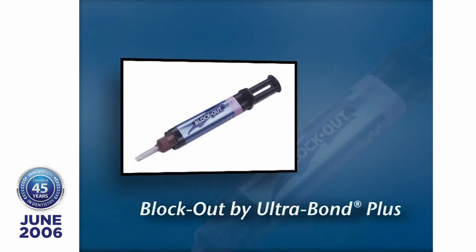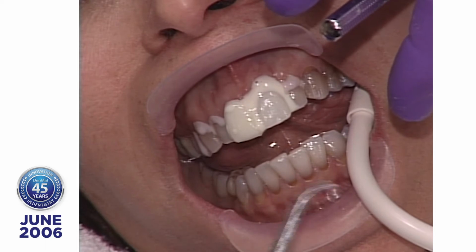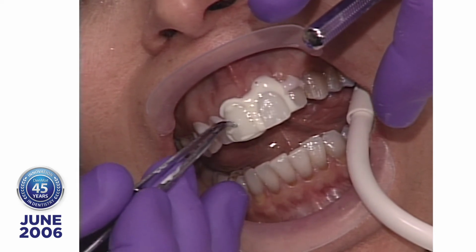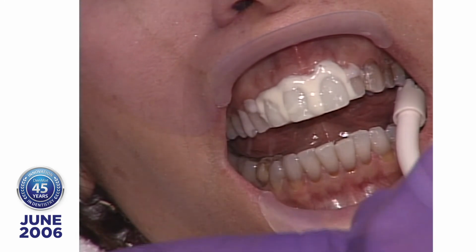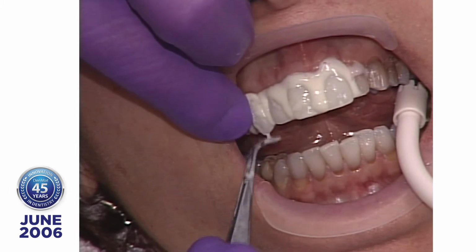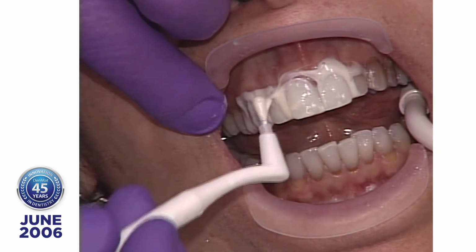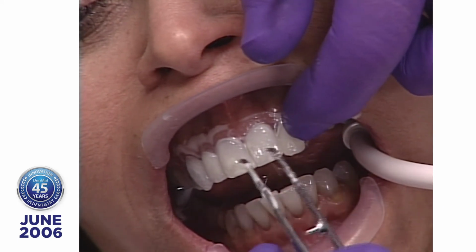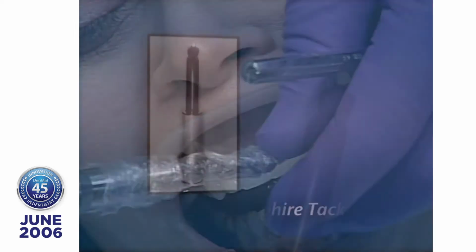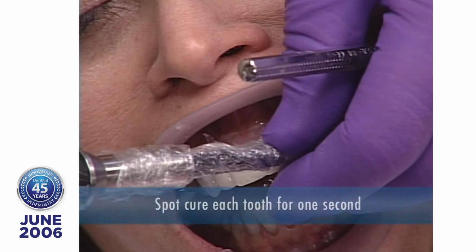Okay. Right central. Right central. And we'll just continue on the right side. Right lateral. Right lateral. Okay. Cuspid. Cuspid. Let's stop for a moment. And you sort of tap these into place, much the way a tile setter or a bricklayer does when they put the mortar on the teeth. Then we're going to go to the 2mm tip for 1 second. You want to be sure that you see excess everywhere. And I always stay away from the last tooth.